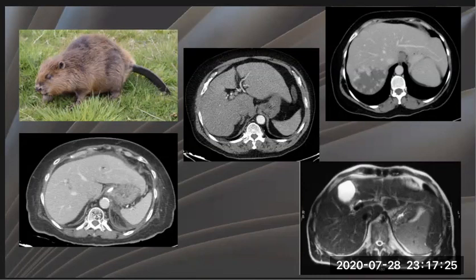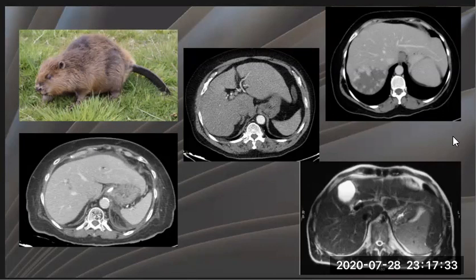On ultrasound, the extension of the lateral segment may appear hypoechoic and looks like a collection, and can be misdiagnosed as a collection around the spleen.